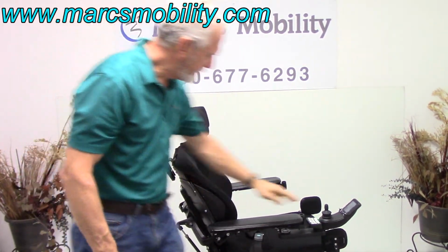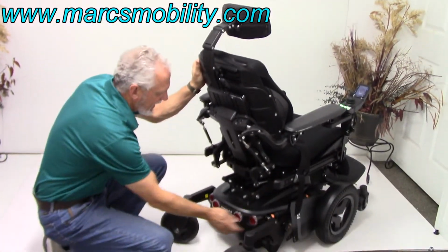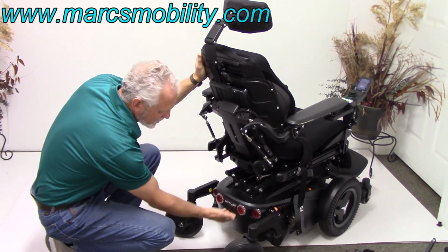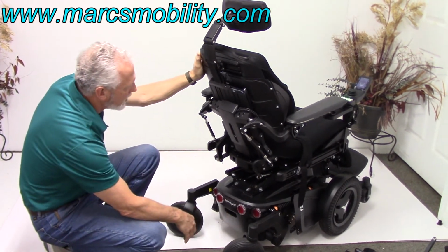On the back of the chair, these are reflectors, they're not lights. These are reflectors only. There's a power button here. We always turn the power off when we shift these chairs. So you put your hand in here, the button is up right in here. So you can flip the power on and off.